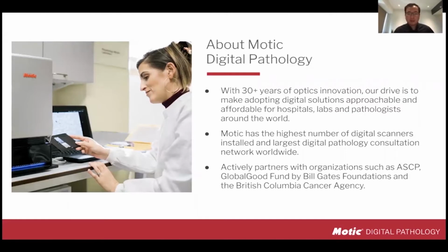Motic has been an optics manufacturer and an optics innovator for the last 30 years. Started from microscopes, and now we're doing scanners and also industrial solutions as well in the optics space. Globally, for the digital pathology division at Motic, we're one of the most widely used scanners in the world.